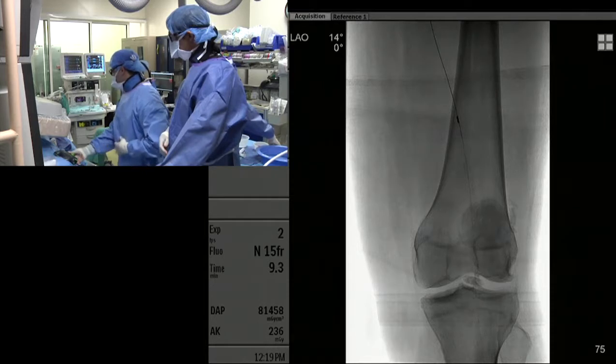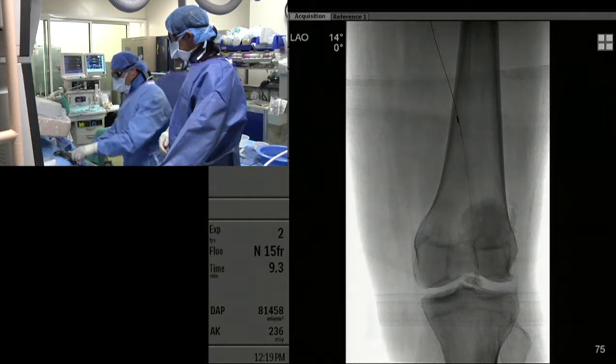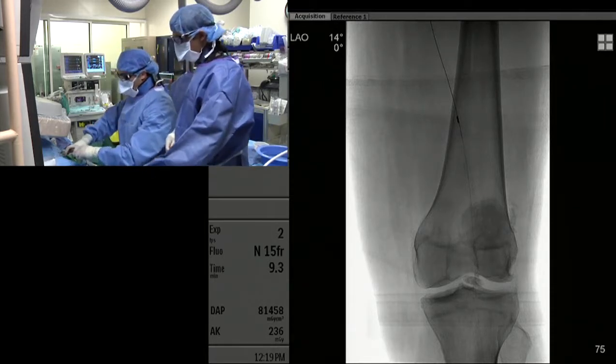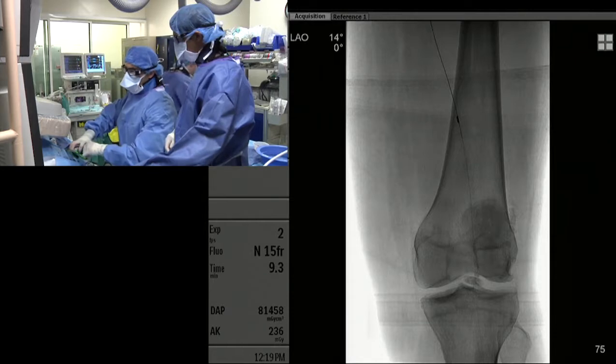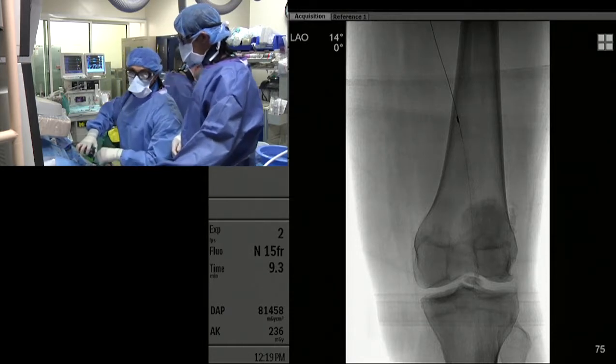We did three passes and got that distal lesion. We're going to exchange this out, balloon, and as long as we get a good result with ballooning, we'll be done.